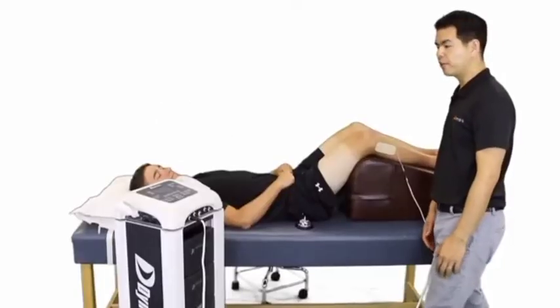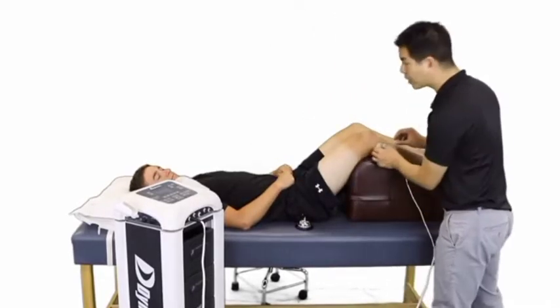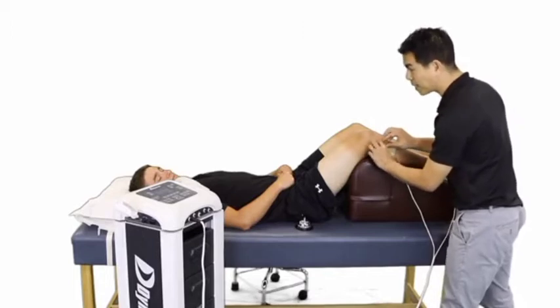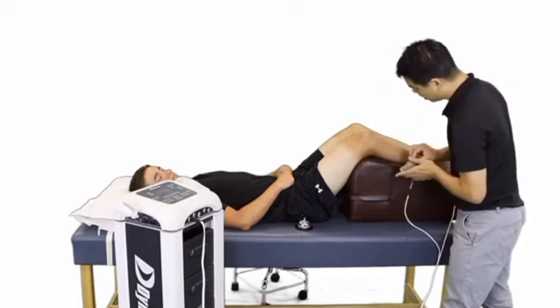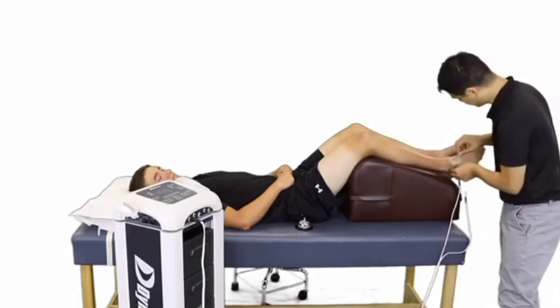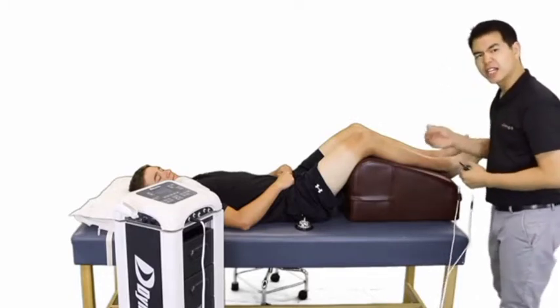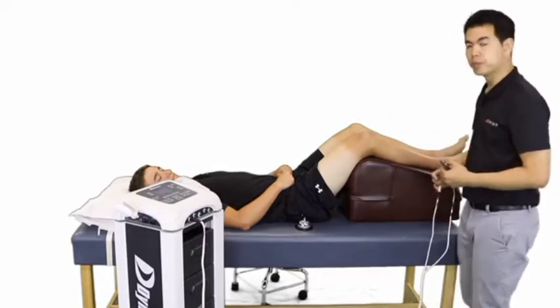After the 30-minute intervention, we are going to ensure that the device is switched off. And now we're going to ask the patient, how are you feeling right now? Good. Okay. I'm going to slowly remove the pad and check your skin. The skin condition looks good. Observing for any rashes or wheals. Otherwise, the patient looks good and the treatment is complete.